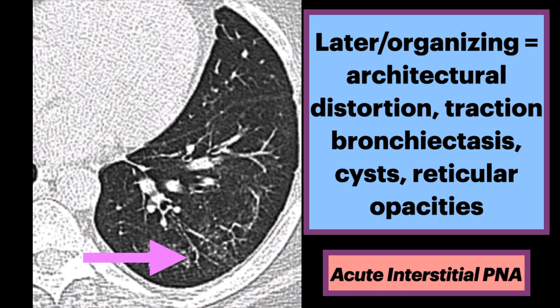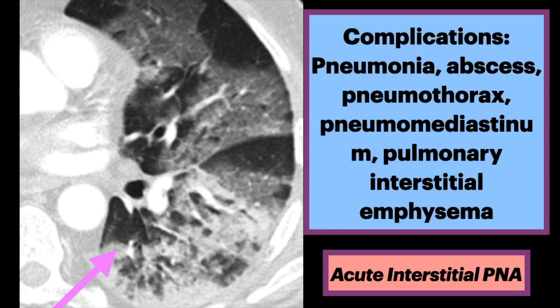Here is another case of late organizing phase with evolution of pulmonary consolidation into areas of reticulation and irregular opacities. Complications include pneumonia, abscess, pneumothorax, pneumomediastinum, and pulmonary interstitial emphysema.